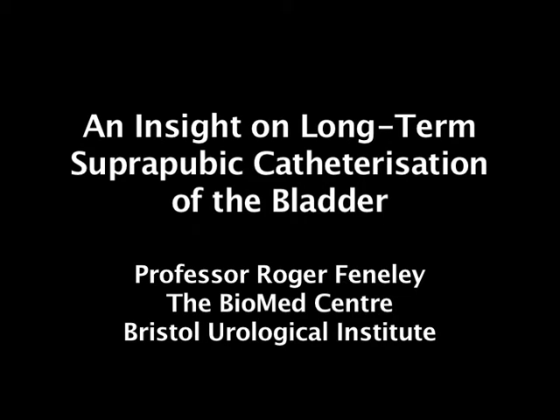This short video highlights features of long-term catheterization not normally seen by the clinician. After 3 months catheterization, the bladder will inevitably be colonized by bacteria. And apart from trauma, infection accounts for all the complications that may arise.